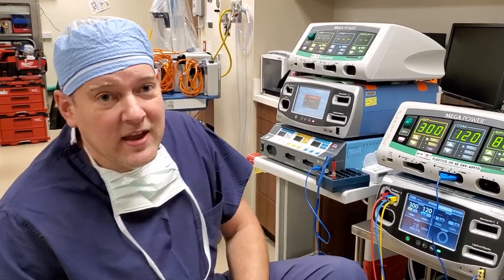First off, let's start out — what is an ESU? Electrosurgical units were invented a long time ago by a man named Dr. Bovie, and that's why to this day people still refer to them as Bovies. It's not a Bovie — it's an electrosurgical unit or an ESU. Biomed should not be calling them Bovies.